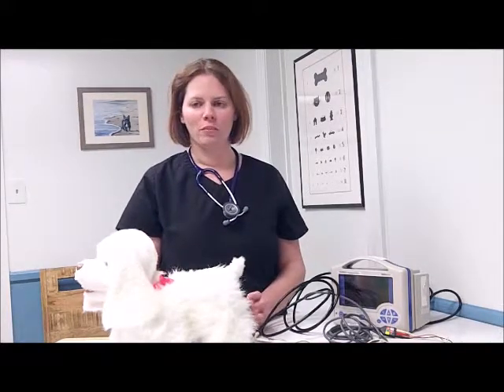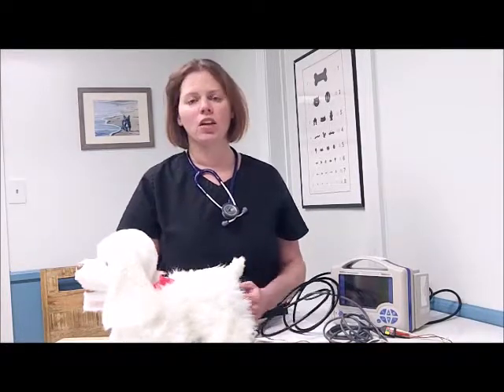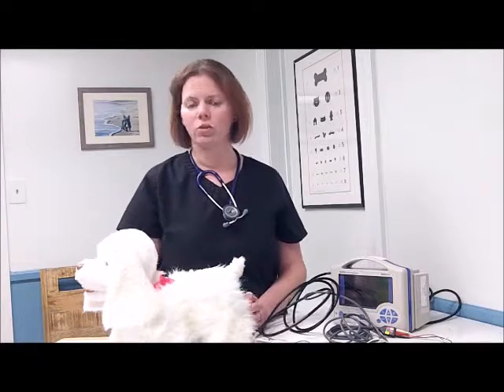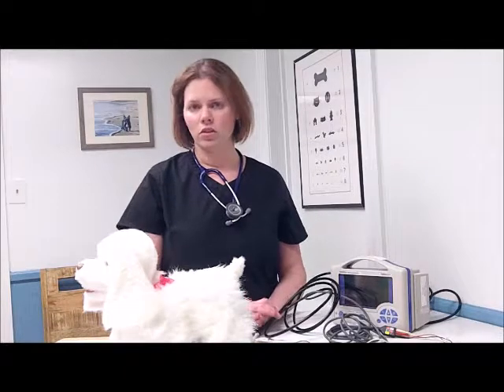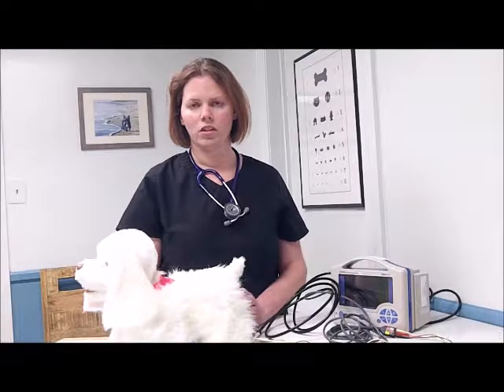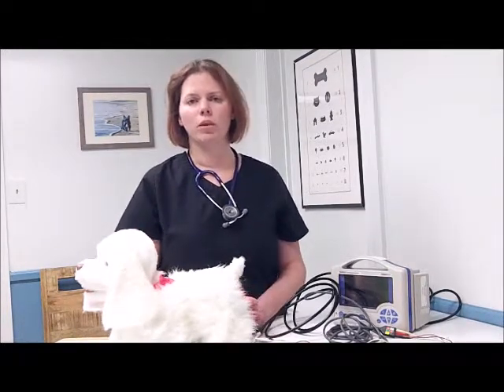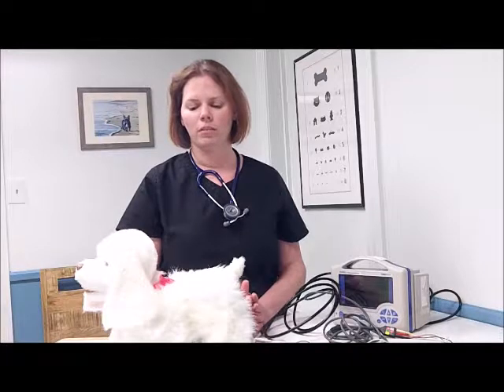We want our patient breathing, obviously. There are different parameters as well. Tachypnea, rapid breathing, can be indicative of a patient that is too light. It can also be indicative of complications with the actual anesthetic machine or the intubation. There could be difficulties moving air. So these are also things that we need to be aware of. A low respiratory rate can indicate the patient is too deep, meaning we need to lighten up the anesthetic. We need to give our patient a breath. We definitely need to be monitoring the rate and the patterns as well.